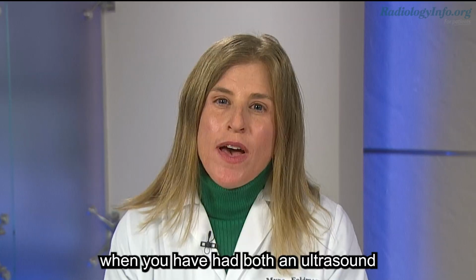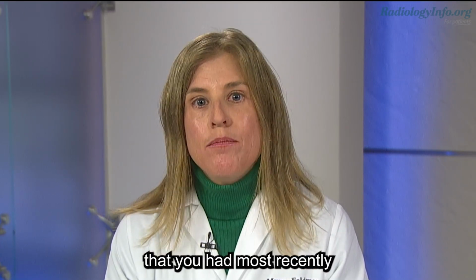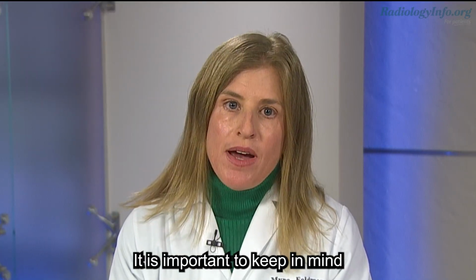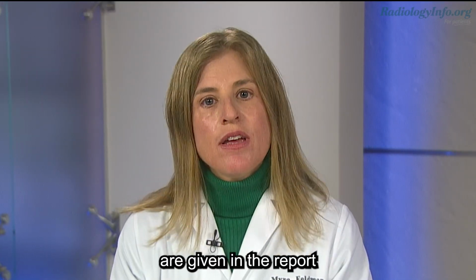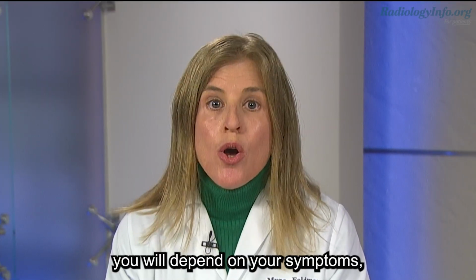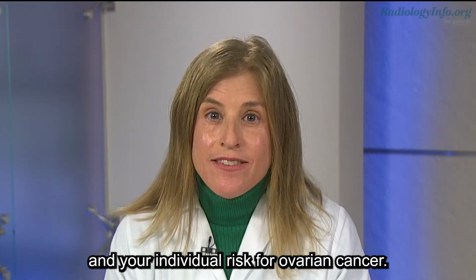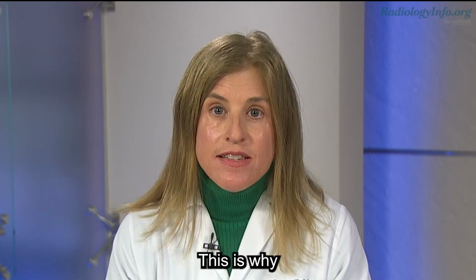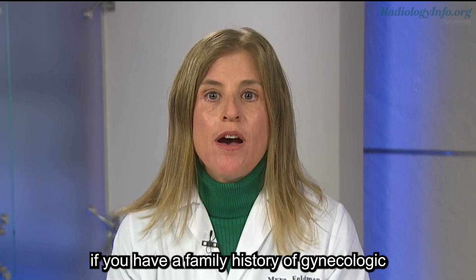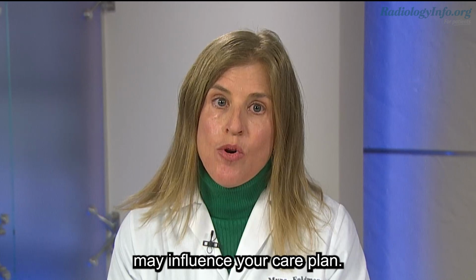In general, when you have had both an ultrasound and an MRI exam, the score in the exam that you had most recently will typically be the one to guide management. It is important to keep in mind that the management recommendations are given in the report only as general guidance. What is best for you will depend on your symptoms, your personal preferences, and your individual risk for ovarian cancer. This is why you should always inform your care team if you have a family history of gynecologic or breast cancer, as this information may influence your care plan.